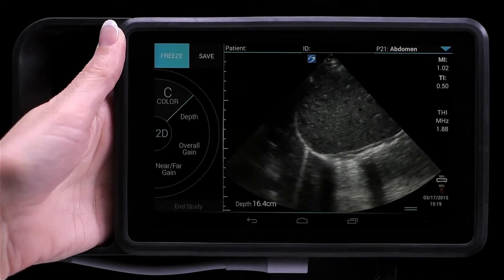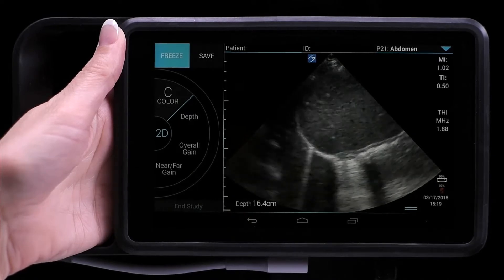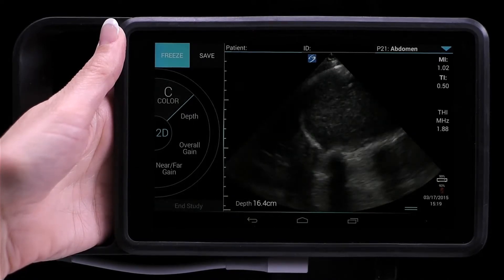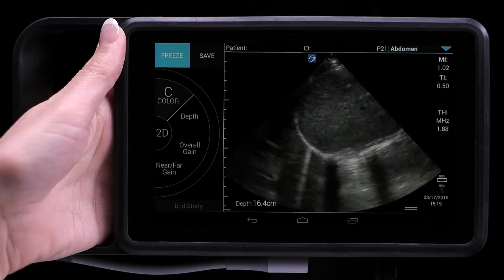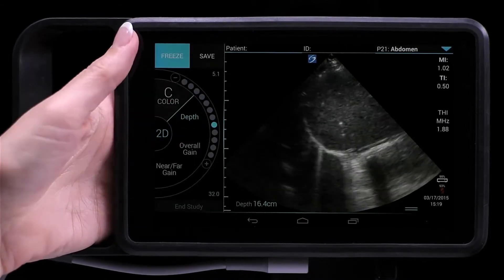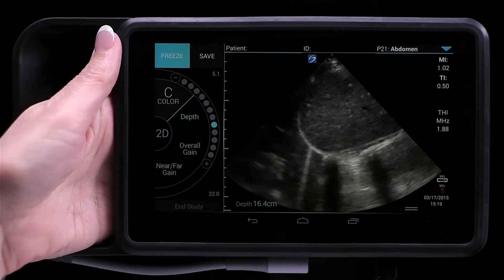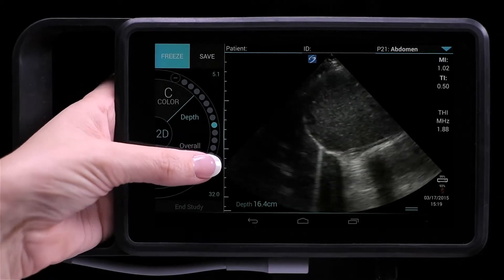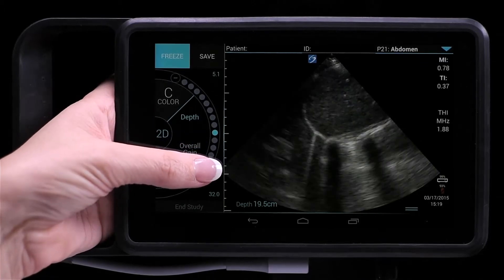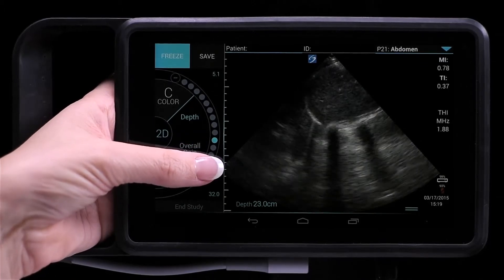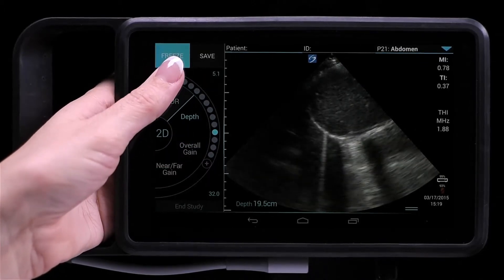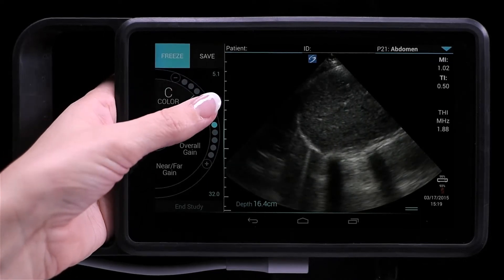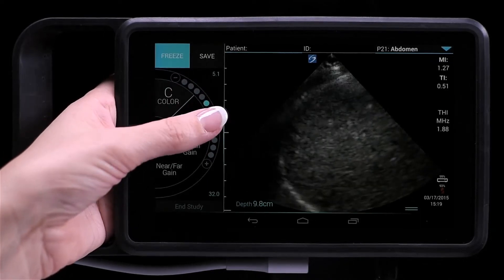The control wheel options are specific to the mode that you're in. You can adjust the depth by tapping Depth on the control wheel. By tapping the plus or minus icons, you can increase or decrease the scanning depth, or tap one of the dots for a specific depth.